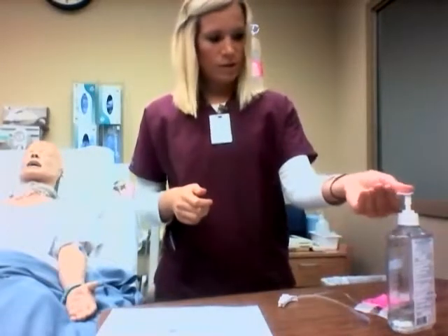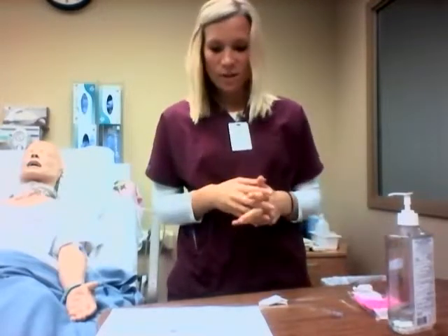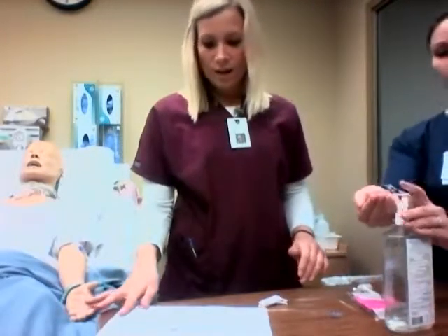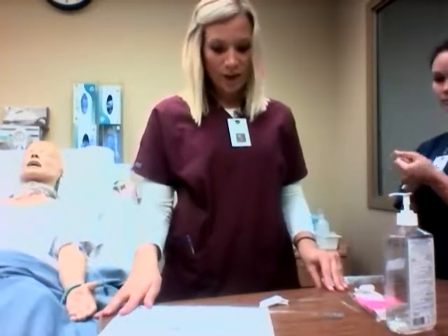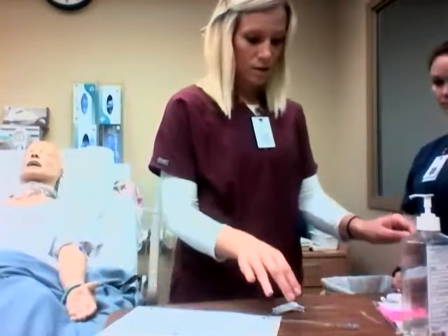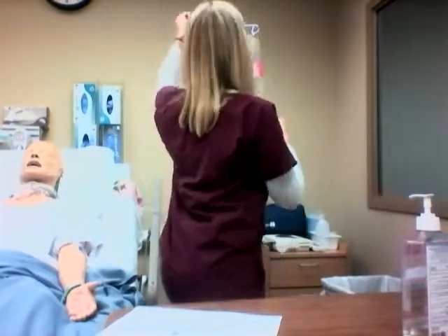Okay, so before I go and hang anything, I'm going to wash my hands, and I'm going to check that I have Cardizem 125 milligrams per 125 mils, and I had already previously checked that this was compatible with the normal saline, so I'm okay to hang it. And I calculated the rate for this. The order called for 0.25 milligrams per kilogram, IV infusion at 10 milligrams per hour. So we will be administering this at 10 mils per hour. Okay, so I've washed my hands, and I'm going to go ahead and get ready to hang this bag.